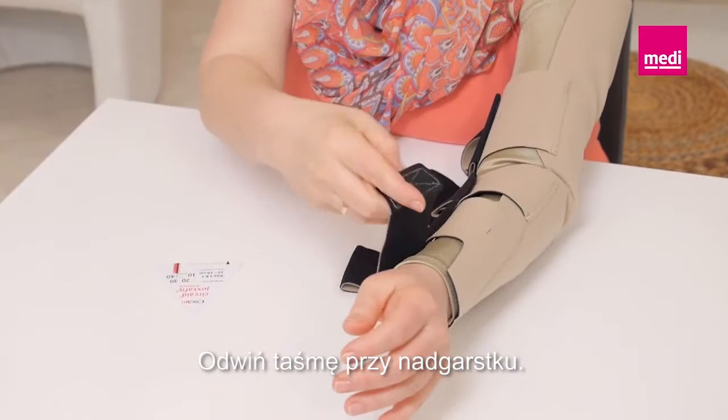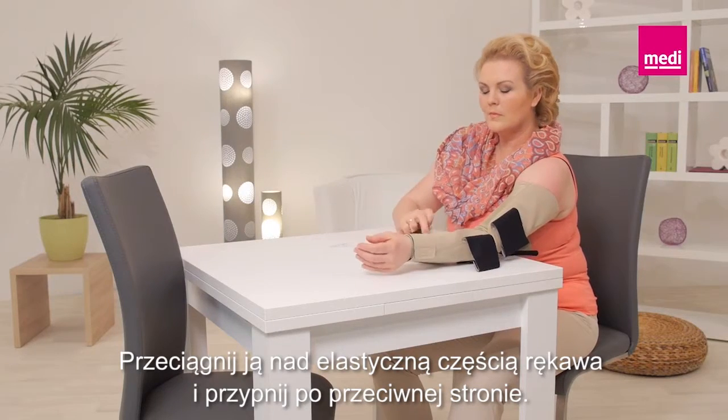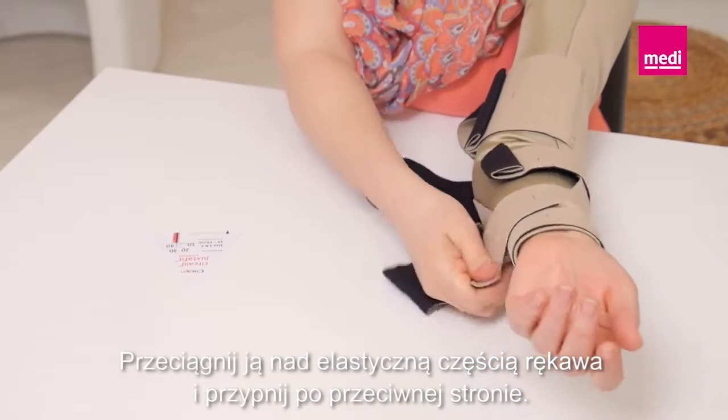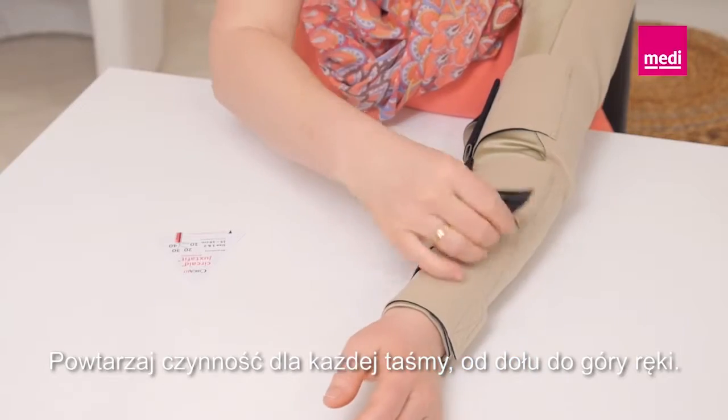Unroll the band closest to the wrist. Pull it across the elastic section of the sleeve and attach it onto the opposite side. Repeat this process with every band, continuing up the arm.